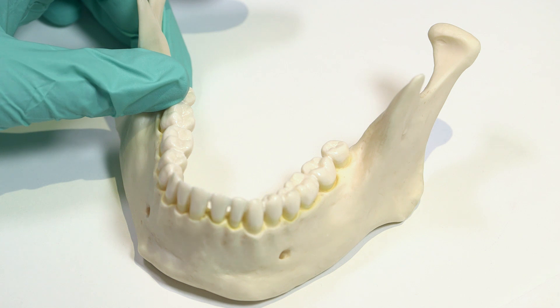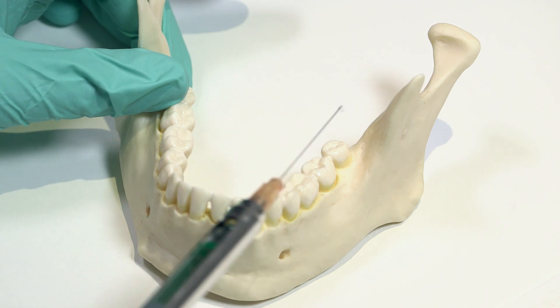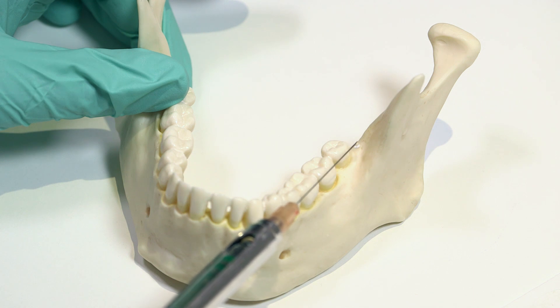You need to orient the syringe so that it is parallel to the occlusal plane on the side of the injection.